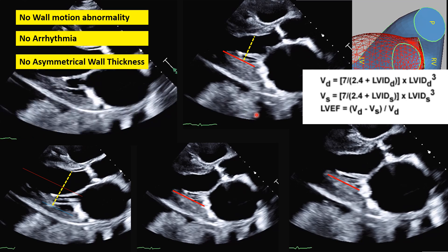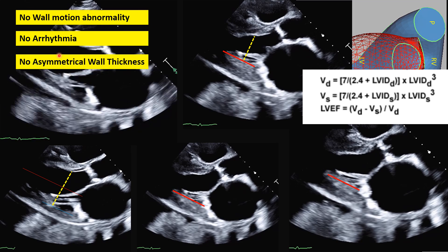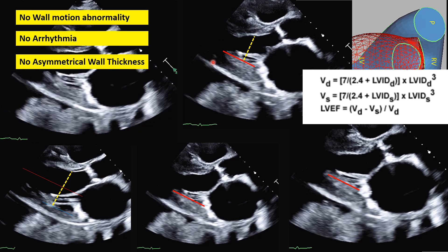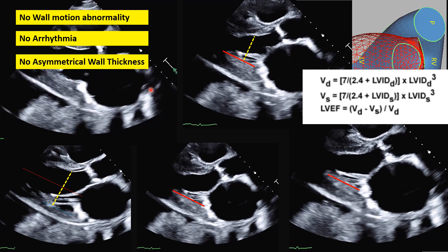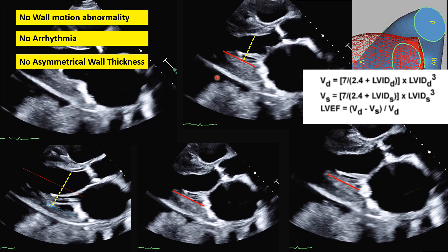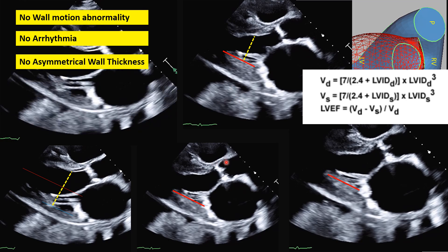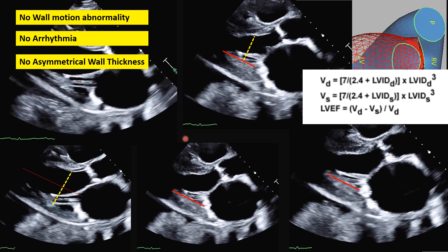Those are the general rules for measuring ejection fraction by 2D or M-mode. To be reliable, none of those conditions should be present, and we need a correct plane without papillary muscles visible and no foreshortening or off-axis imaging. We then go to the beat with the largest diameter, because breathing and small changes in heart position alter the angle slightly. If we acquire three beats, we find the one with the largest diameter at diastole and systole and measure that one.